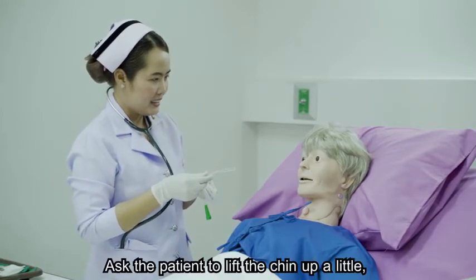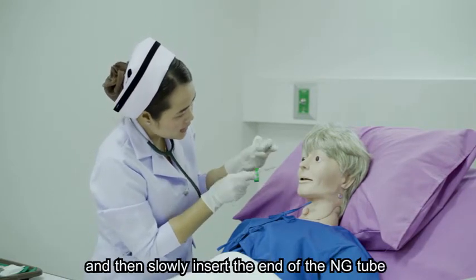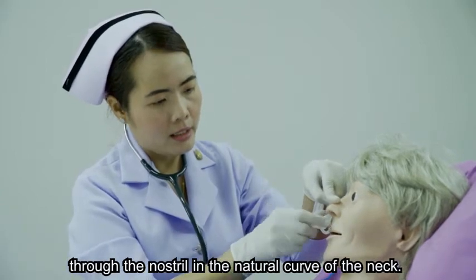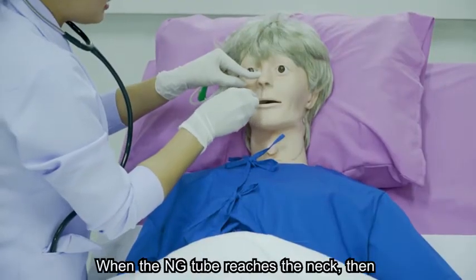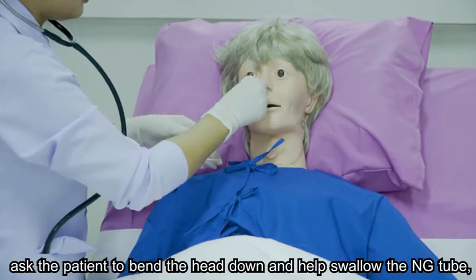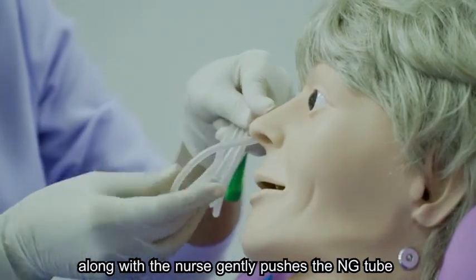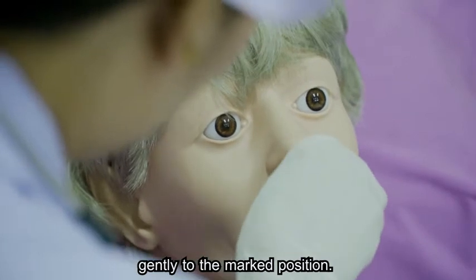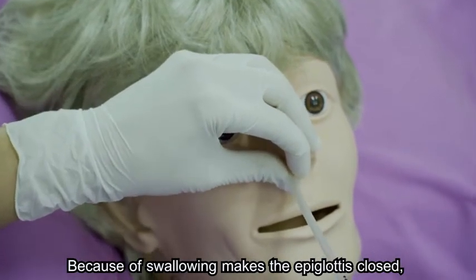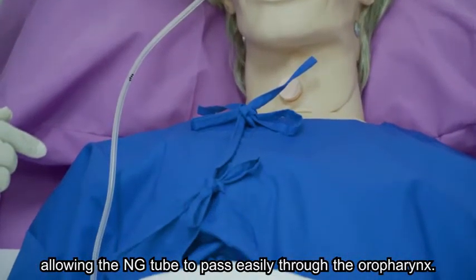12. Ask the patient to lift the chin up a little. Then slowly insert the end of the NG tube through the nostril, following the natural curve of the neck. When the NG tube reaches the throat, ask the patient to bend the head down and swallow to help the NG tube along, while the nurse gently pushes the NG tube to the marked position. Swallowing makes the epiglottis close, allowing the NG tube to pass easily through the oropharynx.